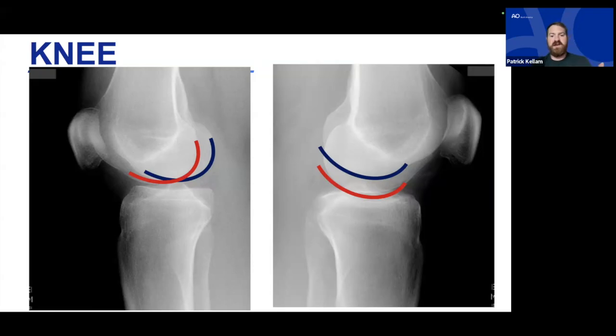So you can use your context clues of your bad image in order to get yourself to a good image quicker. So you're not taking 4, 5, 6, 7 different shots to try and get there. You can take maybe 1 or 2 extra shots to get closer.